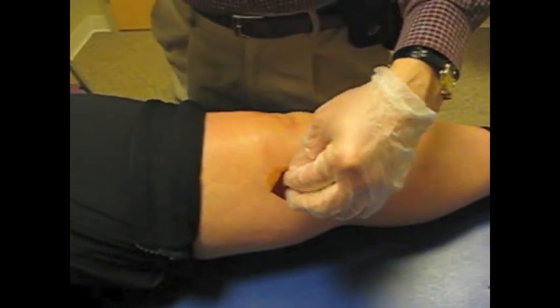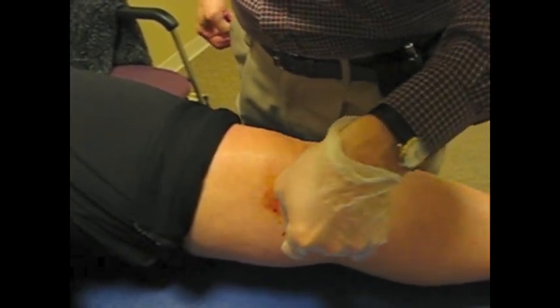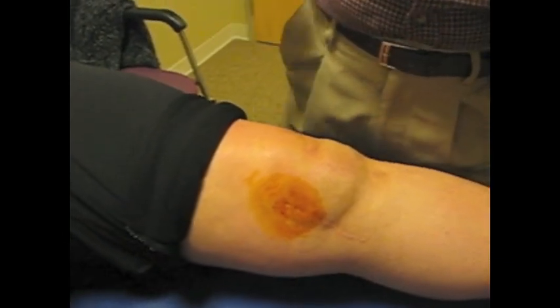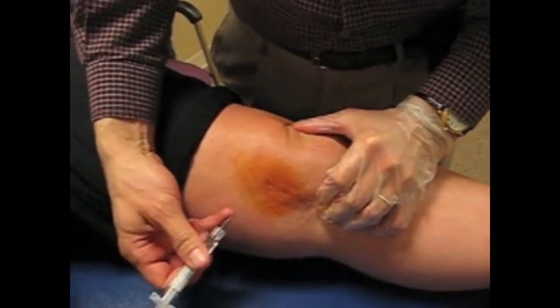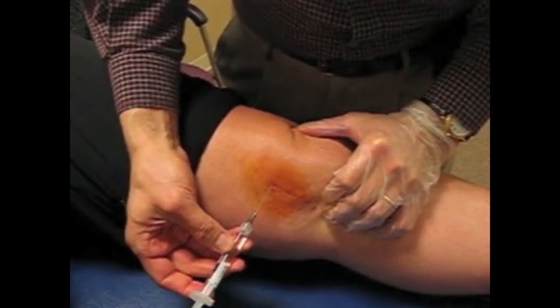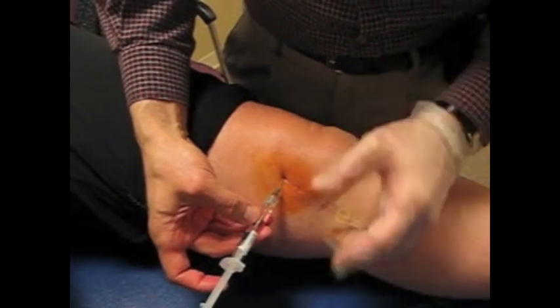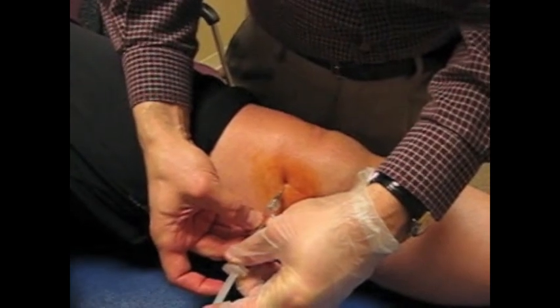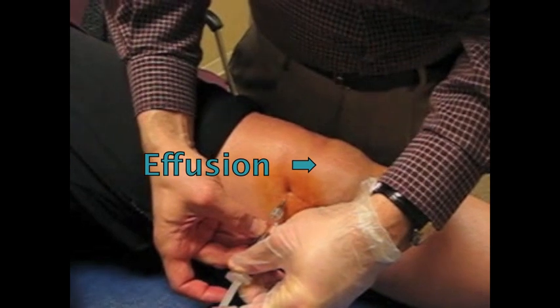With the patient lying supine, with the knee slightly flexed to about 5 degrees, establish the landmarks and cleanse the area as previously explained. Insert the needle at the point of insertion and direct the needle towards the opposite patellar midpole. In this case, notice that the doctor's thumb was kept maintaining mild medial displacement of the patella. The bulging area observed is an area of effusion, not the patella.